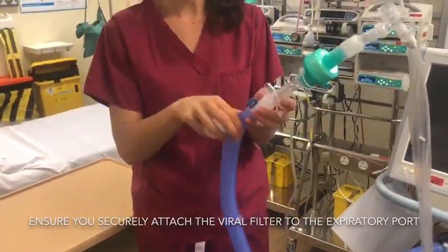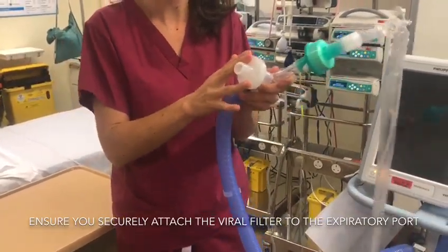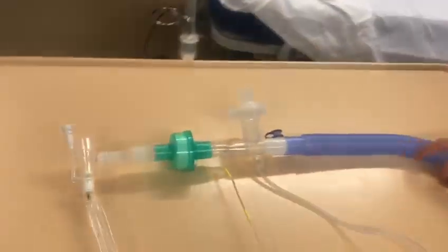The viral filter goes on the expiratory port. Make sure it's nice and tight. This will protect you and your colleagues. So a complete tube setup like this.